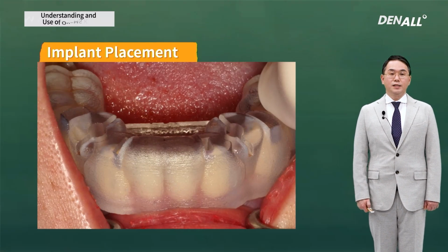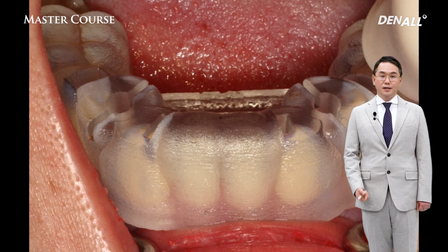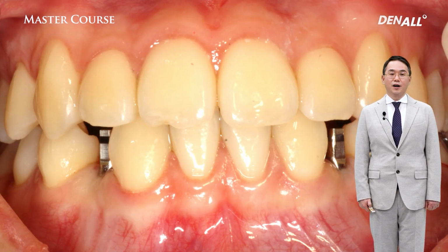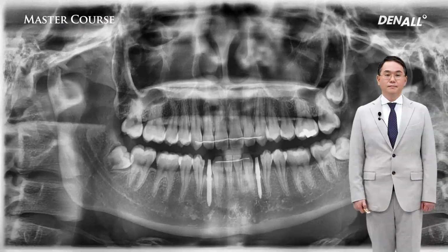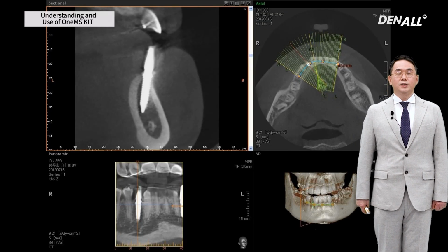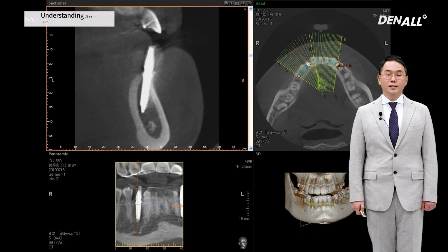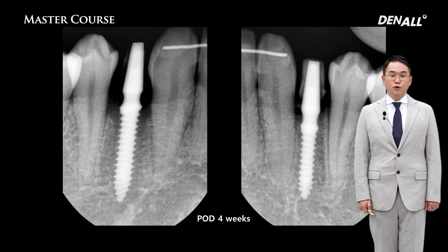The template is delivered into the mouth using the OneMS kit. As I said before, the drilling is done to place an implant, and the flap is not raised. After the placement, a prefabricated PMMA crown is cemented. Post-op panorama and PA: as you can see on the CT, the buccolingual width is very limited, but in terms of the positioning and the relation with the opposing teeth, the implant is placed in an ideal position.